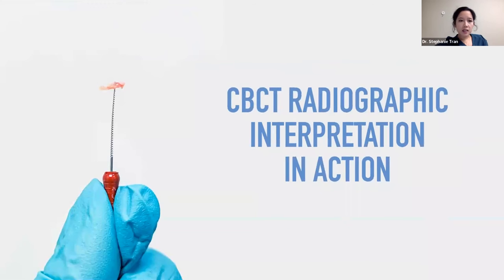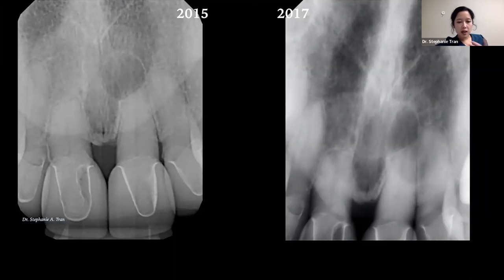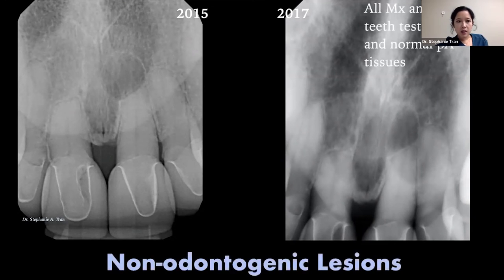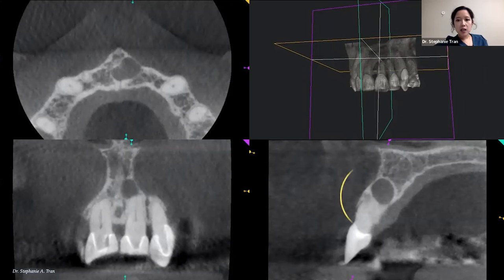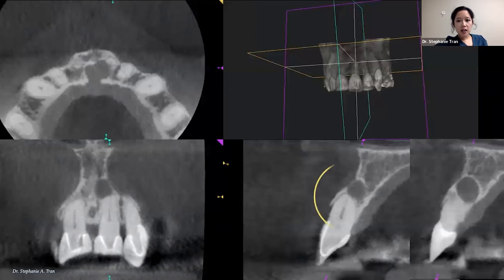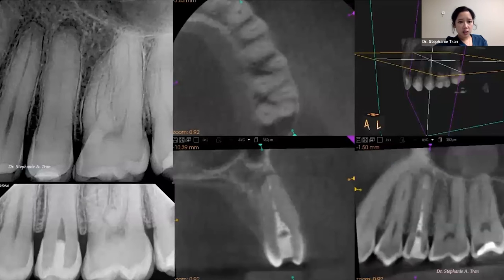When looking at CBCTs, one big rule of thumb: if a patient does not have certain symptoms that match but there is a lesion, we definitely want to be cognizant that there might be a non-odontogenic lesion — away from the tooth, possibly a cyst or some other sort of non-odontogenic lesion. Another thing we want to use a CBCT for is evaluating very calcified, obliterated canals. We always want to compare the tooth in question to the adjacent teeth, because that tells us which tooth is the different one.